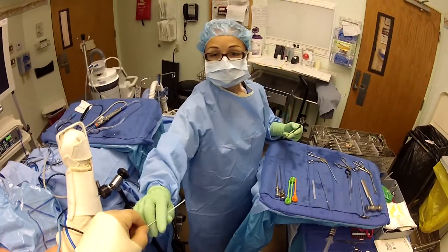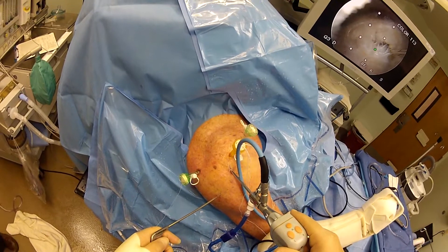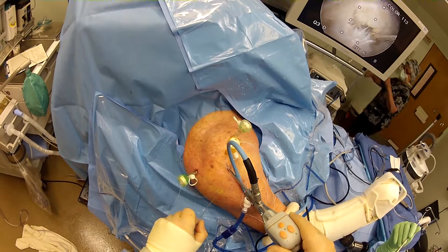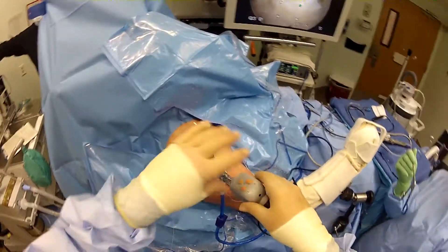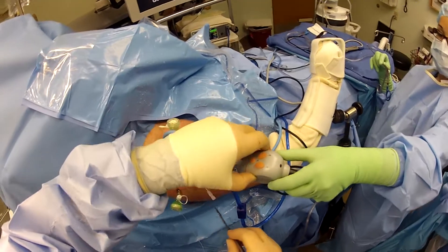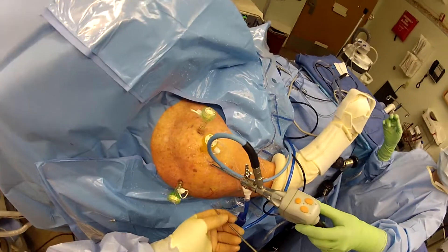So I just poked through. Hand me a knife — actually hand me that 18-gauge needle in. If you took it out too fast... Okay, hand me a knife. I'm going to poke that skin. This skin is kind of tough, so we're going to make just a little nick to get that device in there. You can see it doesn't take much.